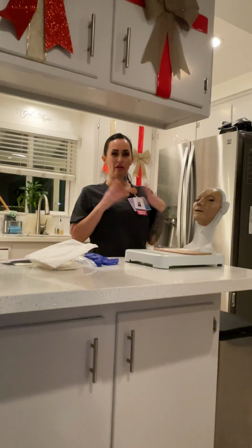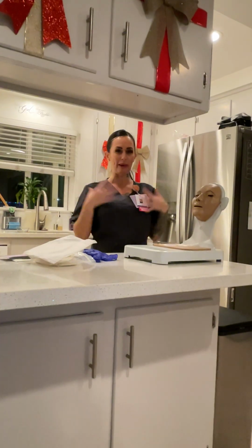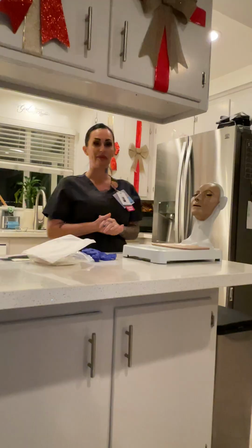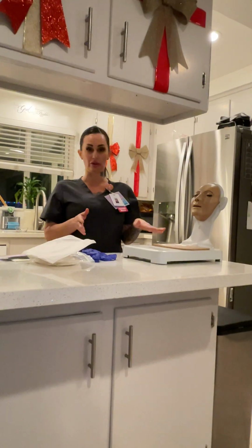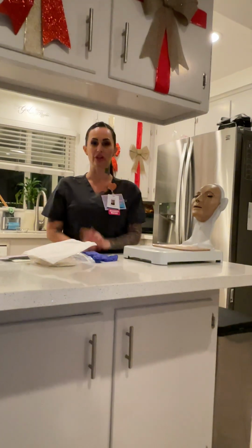I do have on all of my appropriate attire, my Nightingale scrub, I don't have any nails, my hair's back, and I have my badge. So what we want to start doing is verifying our physician's orders, which I've already done in the computer. I will then gather my supplies, which I have here.